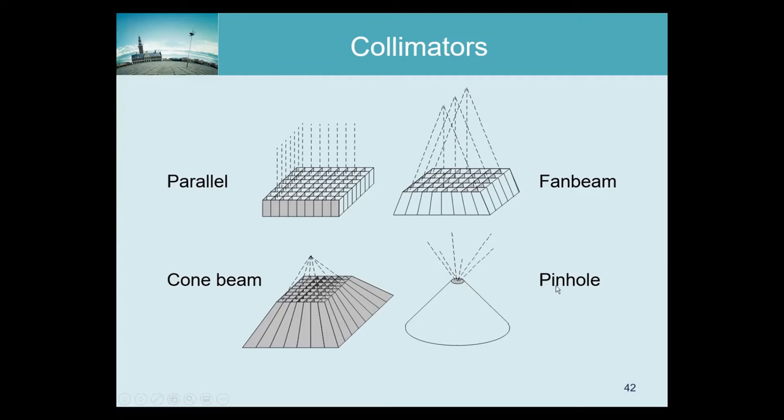So the nice thing about pinhole is that it's really very easy to make. And it's easy to control the resolution and the sensitivity. That's just determined by the size of that hole. In addition, it gets very strong magnification. So if you put a small object here, then you can see that these lines will create a very strong magnification of that object to the crystal.